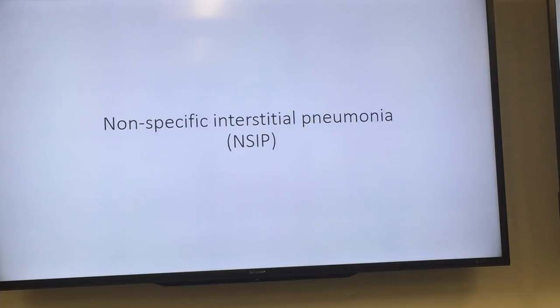I think what pattern really means is, and this is my opinion, I think people say pattern when they're not sure that it's UIP. They go, well, I'm just saying pattern. I'm not saying it's UIP. So that's really the truth behind this pattern business. If you know the patient has connective tissue disease, yes, it's still UIP. Why not? If the pathologic criteria are met, it is UIP. In fact, there is actually pretty good evidence that regardless of the underlying setting, regardless of what is causing the UIP, if you have UIP on pathology, it behaves identically, the same. It's poor prognosis and relentless.